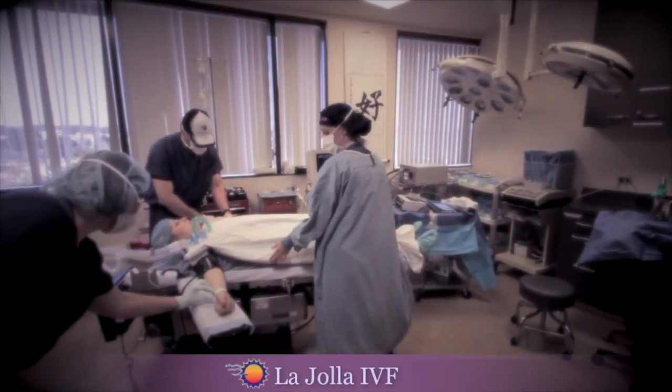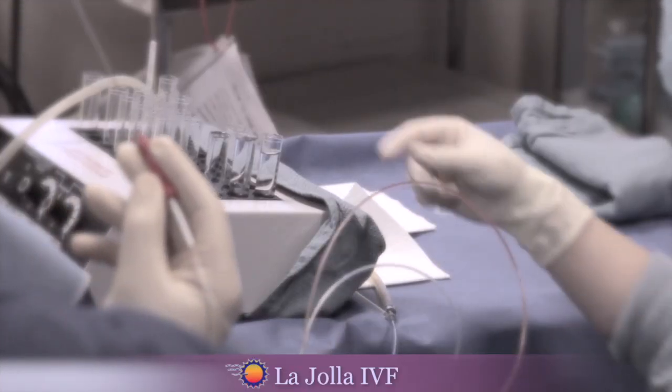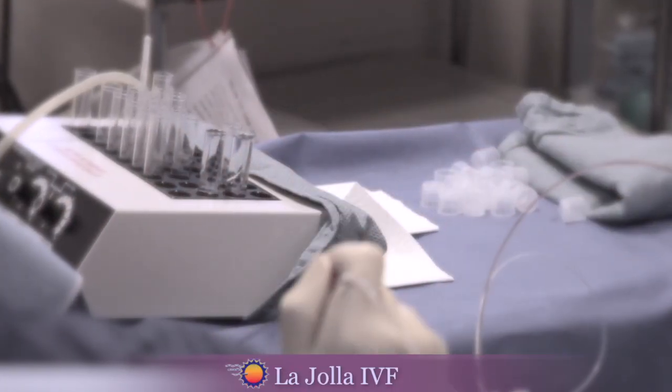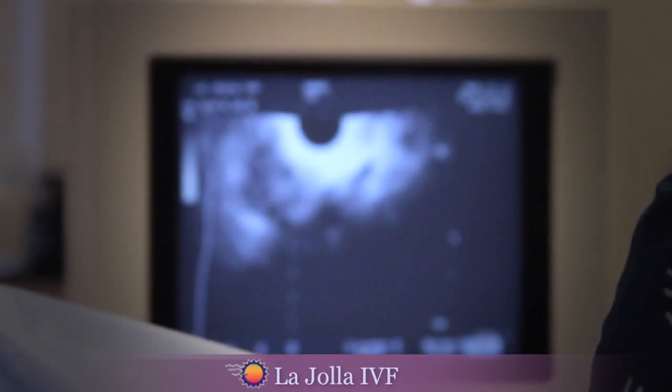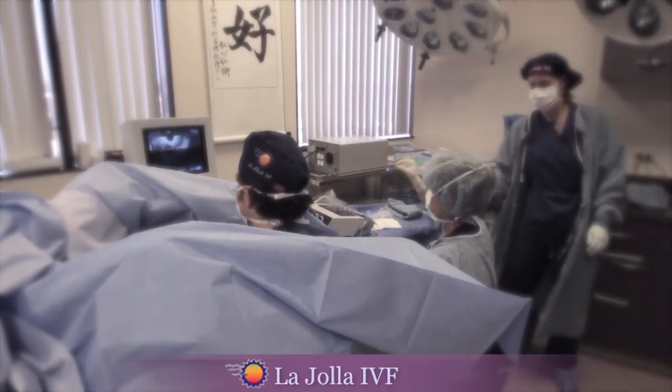During egg retrieval, while the patient is sleeping comfortably under anesthesia, an ultrasound guided needle is used to aspirate fluid from each ovarian follicle. The aspirated fluid is then handed to the embryology lab to be examined by our experienced team.